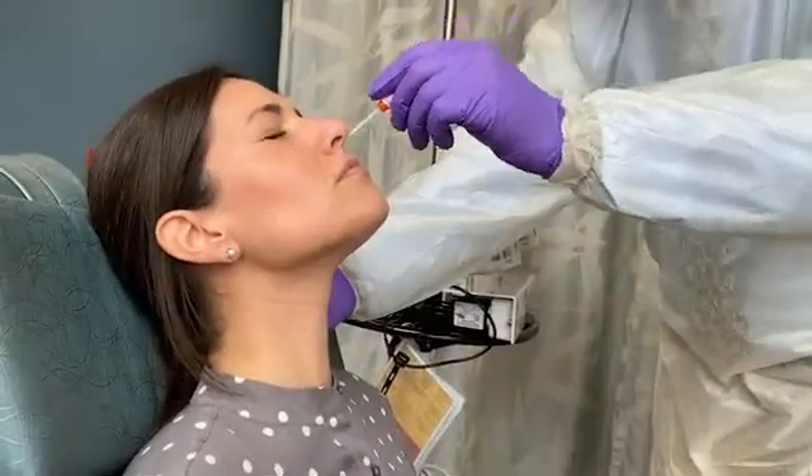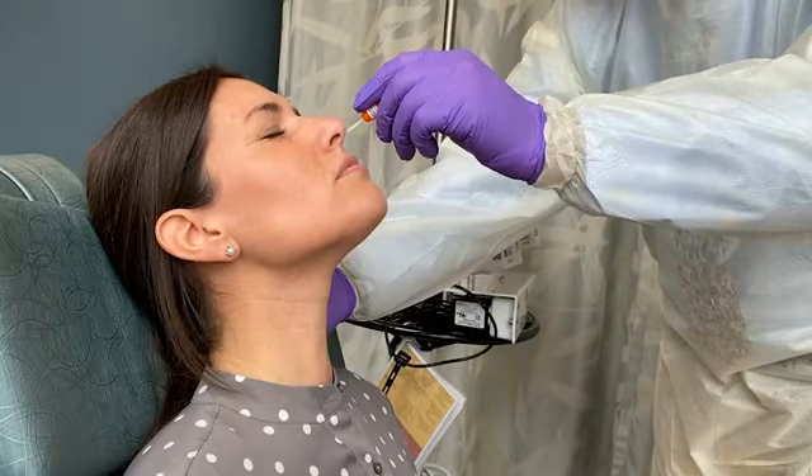Ask the patient to close her eyes to lessen the mild discomfort of the procedure. Gently insert the swab along the nasal septum, just above the floor of the nasal passage, to the nasopharynx, until resistance is felt.